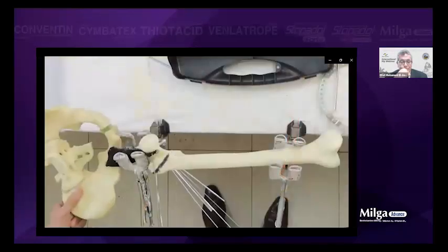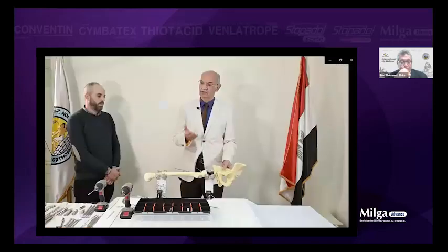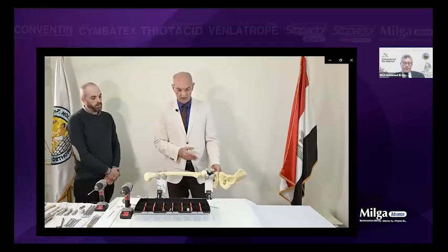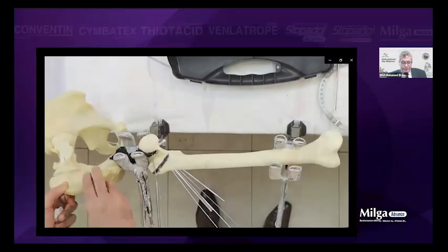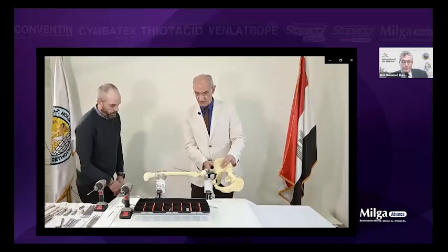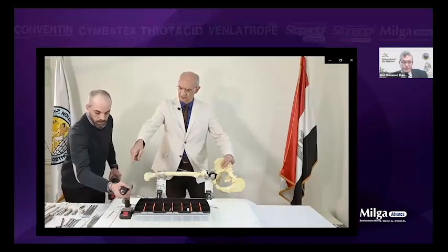The supraacetabular area is very important. It's good, it's hard, it's easy to apply, and you just have an image, and you can put your half pins in this direction. So you can augment the fixation of the proximal femur by adding supraacetabular half pins. And I will show you an example of how to use the supraacetabular half pins. This is the acetabulum. Give me a wire.